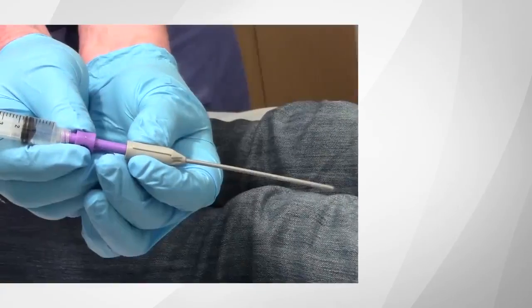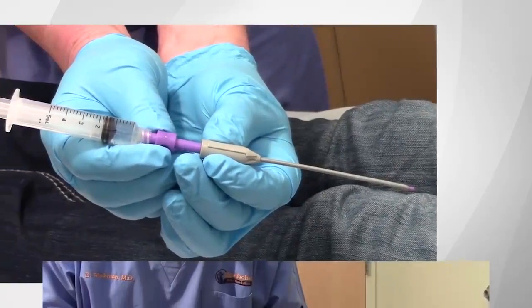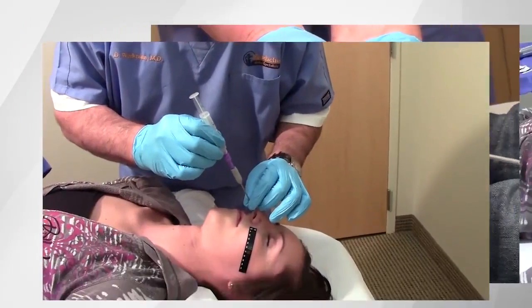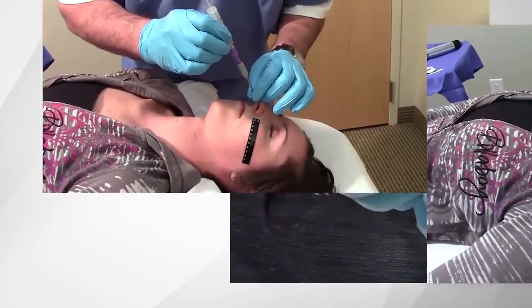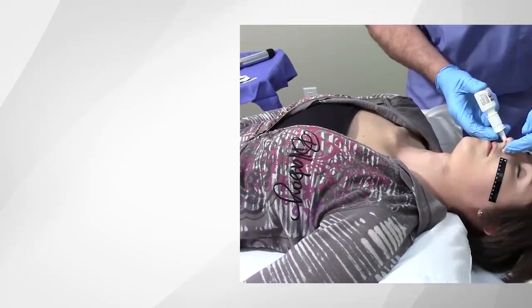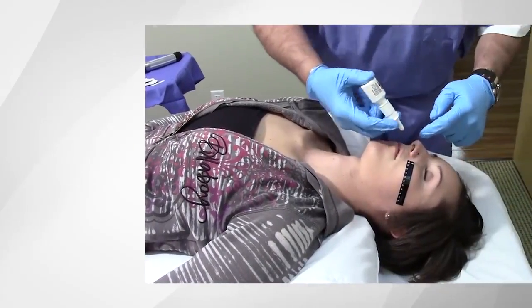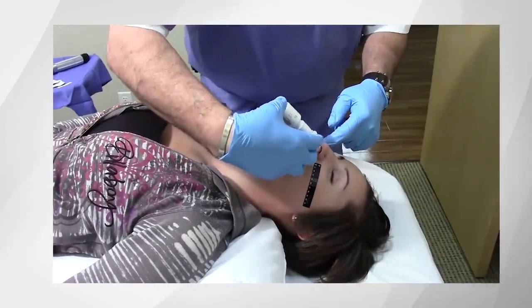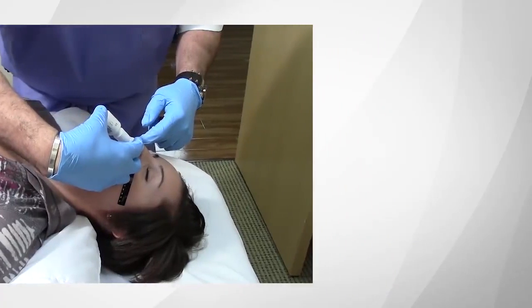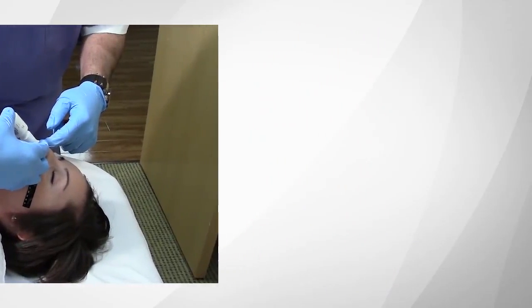These and other important nerve fibers contribute to the central autonomic and sensory components of headache pain. This sphenopalatine circuit can be blocked without needles and without pain. Accurate placement of the local anesthetic can be accomplished in minutes and provides delivery of the anesthetic to the entire sphenopalatine circuit, V2, producing outstanding results.